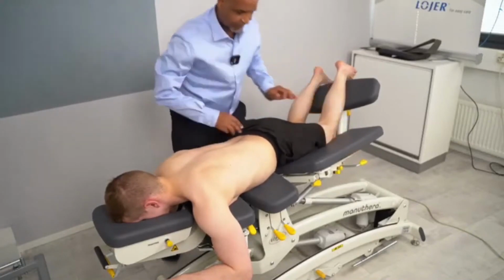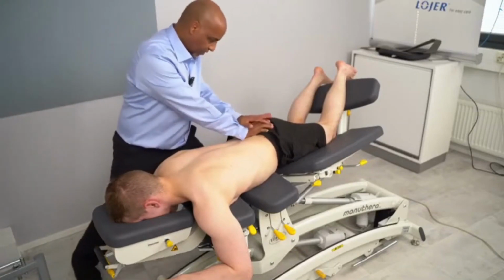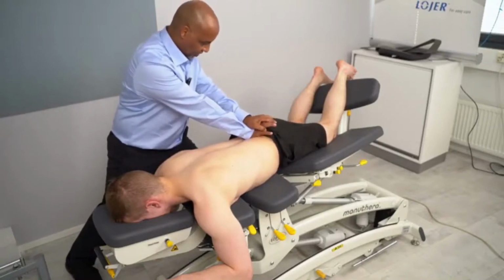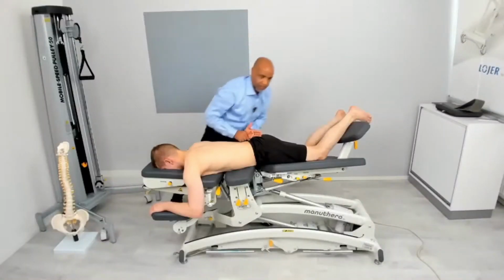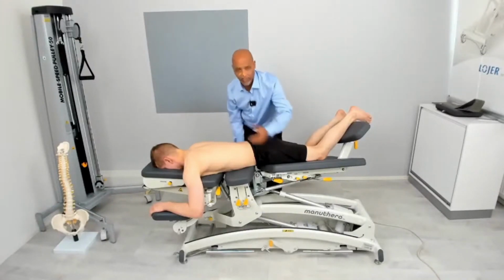So I will activate the drop, and I already opened this particular point. So my striking angle will be in this particular section or direction. So it's going to be a specific force toward that. It's going to be that angle to open up one specific joint, and it can be repeated a couple of times, and then you do the other side.